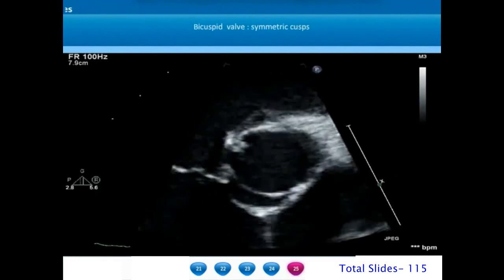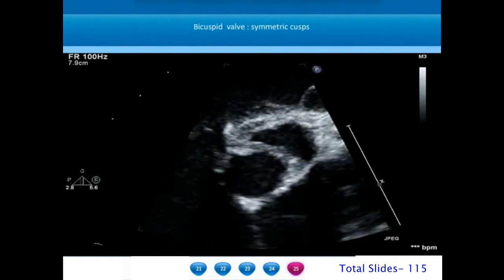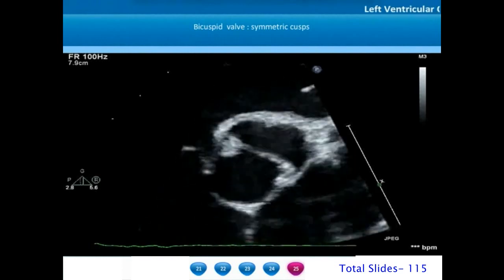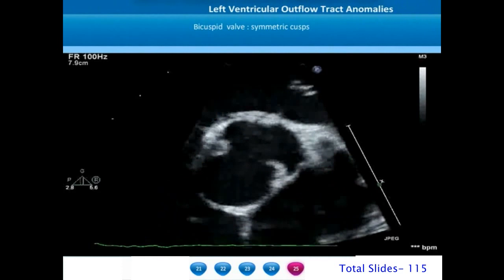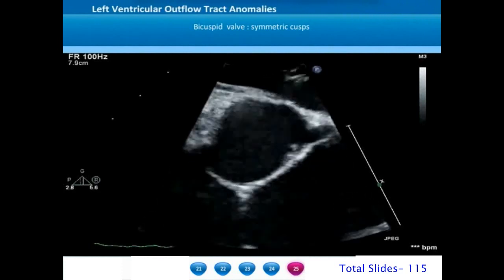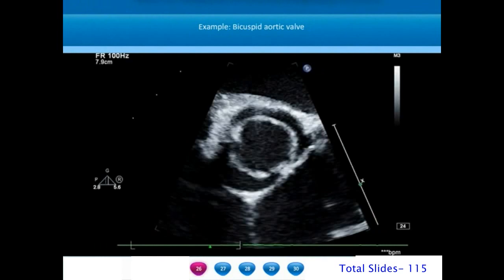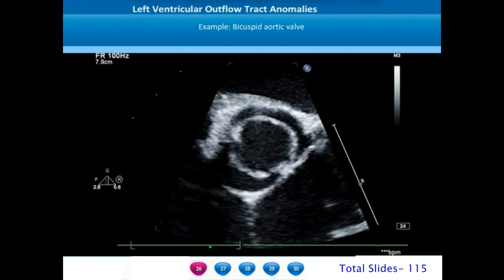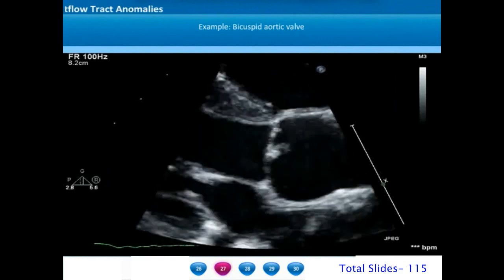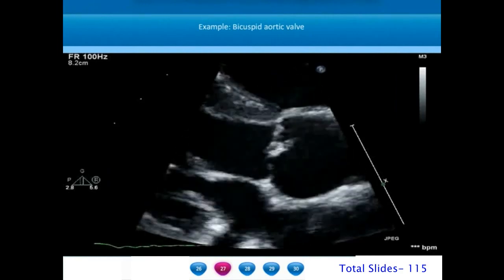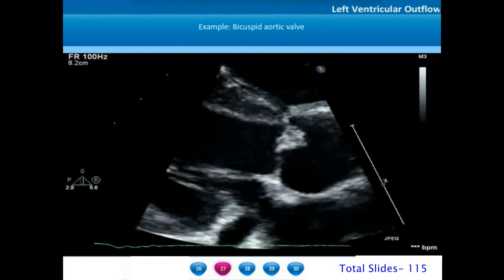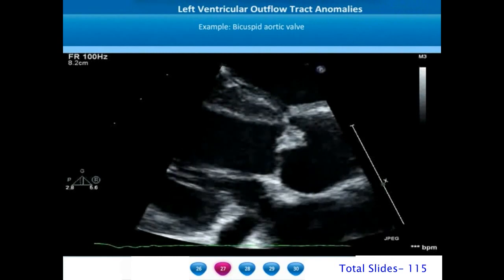In some patients the cusps will be very symmetric. This is an example of a truly bicuspid aortic valve with no raphe formation — two cusps that are more or less symmetric. On a frozen systolic frame there are two commissures on either side with symmetric and equal cusps. On long axis there is substantial doming of both leaflets in systole, and the aortic annulus is measured at the anterior and posterior hinge points.